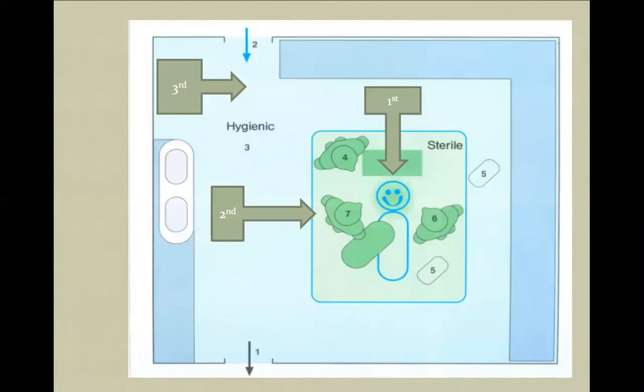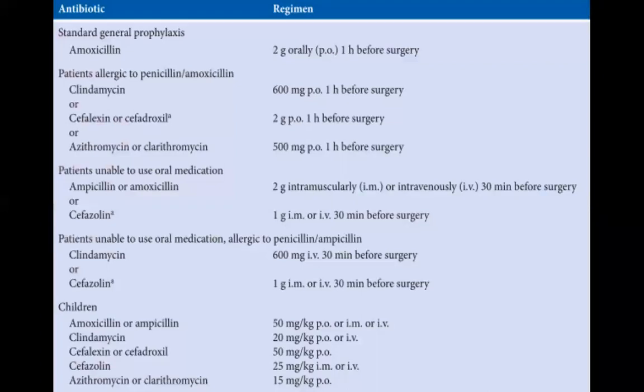Sometimes you will also have an anesthesiologist as anesthesiological support, if you're doing your procedure under general anesthesia, or you need deep IV sedation. So there will be an anesthesiological team. What about the preparations? The preparations for this kind of surgery do not differ from the preparations done for surgical tooth extraction, for example.